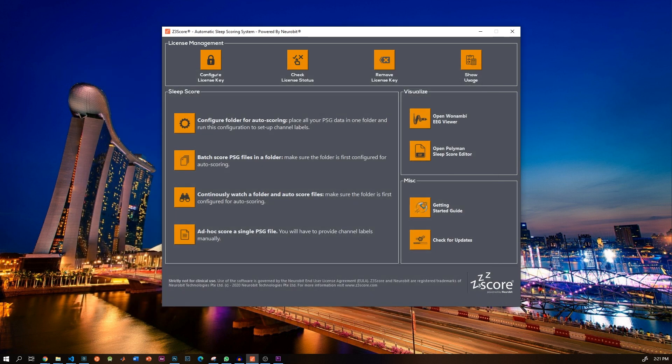Of course, you can simply use whatever software and workflow that you are currently using, like Compumedics or Remlogic, and just import the sleep scores directly into these software. If your software vendor is not supported right now, contact us and we will work with you to add support.